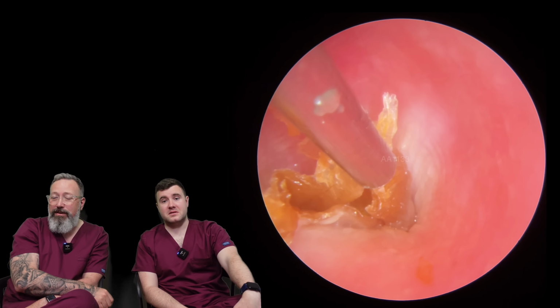Oh, there you go, there you go, there you go. How deep that was. That was a lot of it, wasn't it? You could see it all the way in there. Look how thick that skin is underneath. Yeah, that's a heck of a recess, that is. Yeah, you can't even see the eardrum fully. It's that steep.